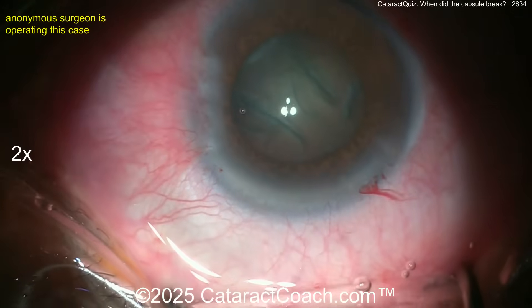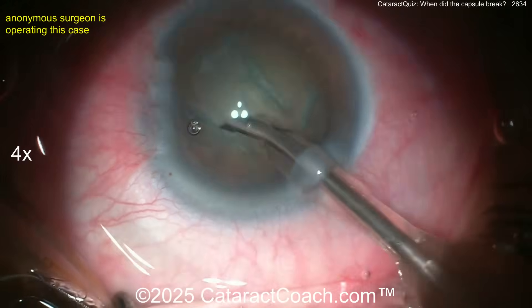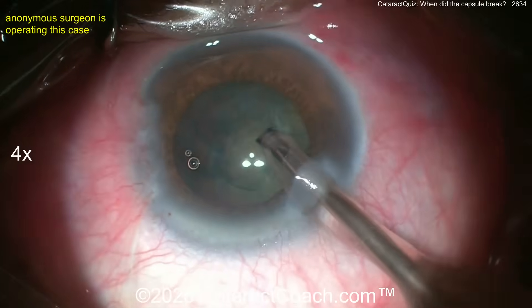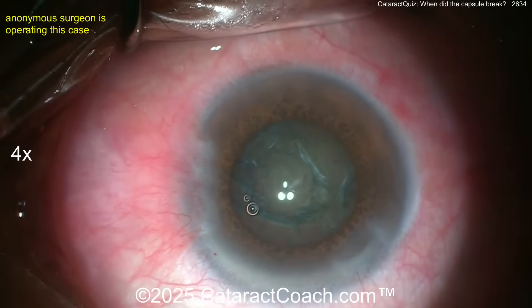I don't know why the patient had a snap sign. Was the rhexis too small? The rhexis looks pretty good. Maybe the patient had prior intravitreal injection which damaged the capsule bag, or some other weakness. But that was the snap sign — very subtle. Go back and watch it again.